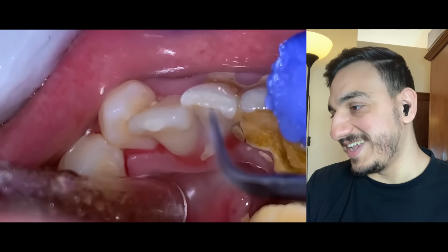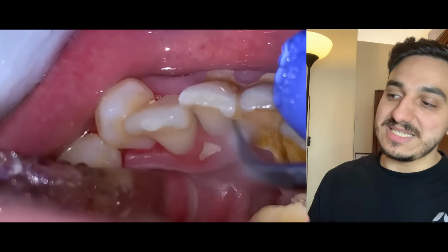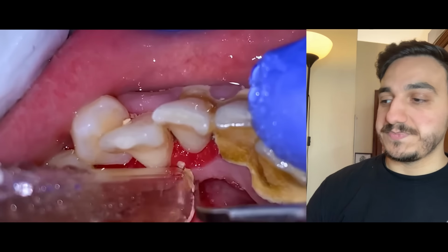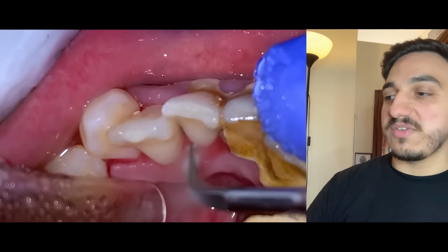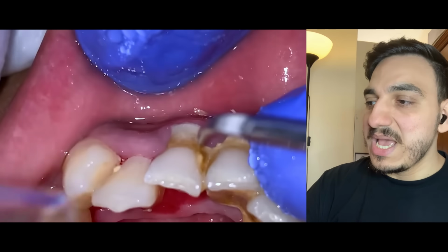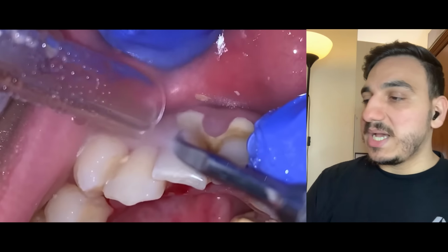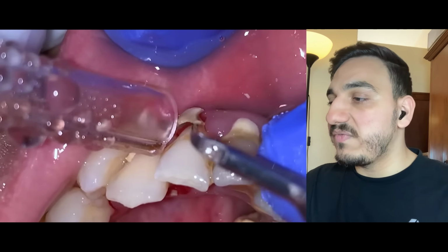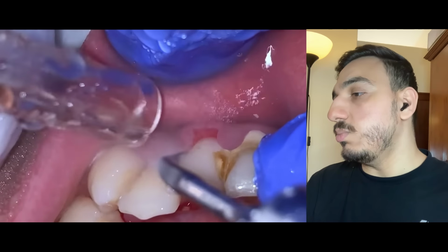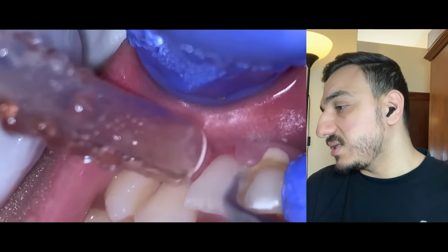The operator here is trying their best to remove as much as possible from these teeth. As I said, there's overlap between these lower front teeth. On the inside you have the floor of the mouth, on the outside that is the lower lip. And look at how extensive that dental tartar is. As you can see, there's subsequent gum recession underneath some of these front teeth. It is going to be more visible when the operator removes these huge pieces of dental calculus and dental tartar.